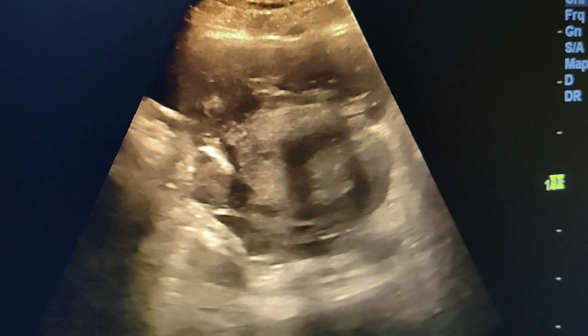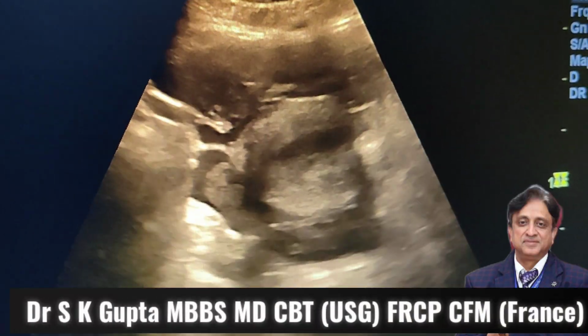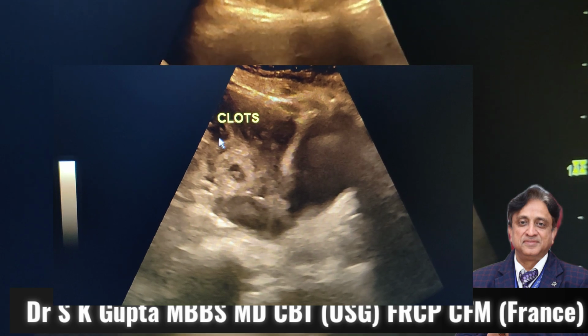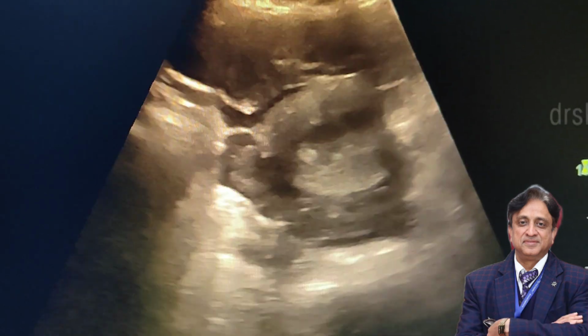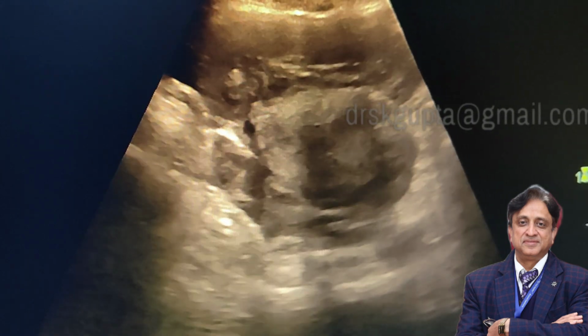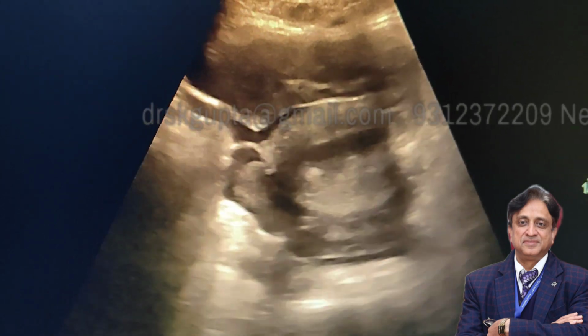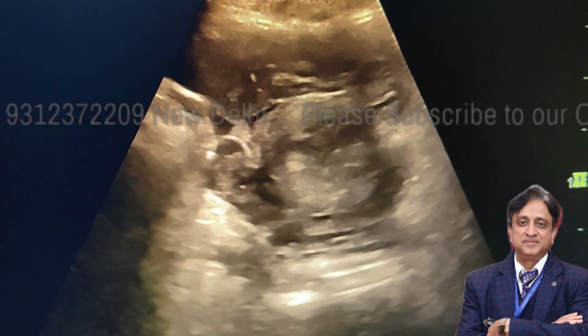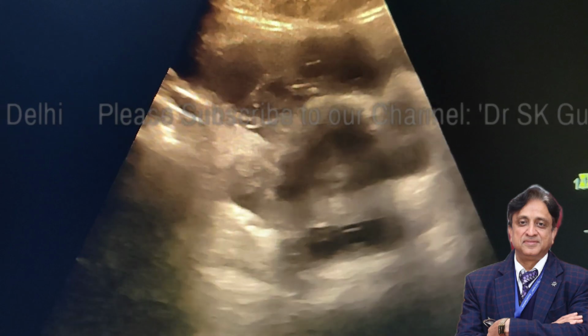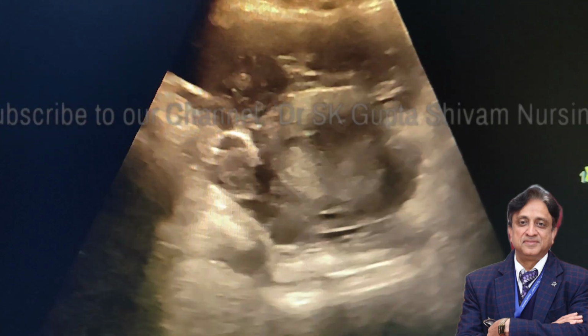Good day friends, I'm Dr. A.S.K. Gupta and I'm going to talk to you about the ruptured ectopic pregnancy. This patient has come to us with severe pain in the right lower part of the abdomen, and she had about 2 months of amenorrhea prior to this pain. She has had excruciating pain since yesterday night.